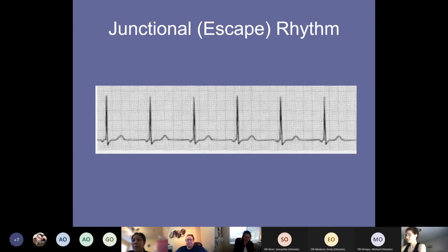Okay, I have a question. Absolutely. Okay, so you said if it's inverted, that's bad, but the whole thing can be inverted and it's fine? That's where I'm kind of confused. Great question. So if you have a sinus rhythm with a PJC somewhere, it's pretty benign, okay? It's not going to bother your patient too much. It's just every now and then. If it's every beat, you're losing your SA, your atrial kick. Okay, yeah, so now it's down to the AV, right? Almost down to the AV.